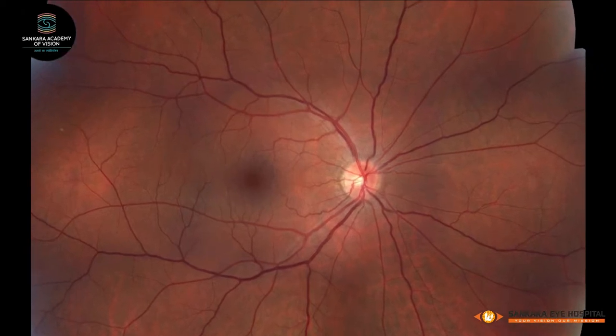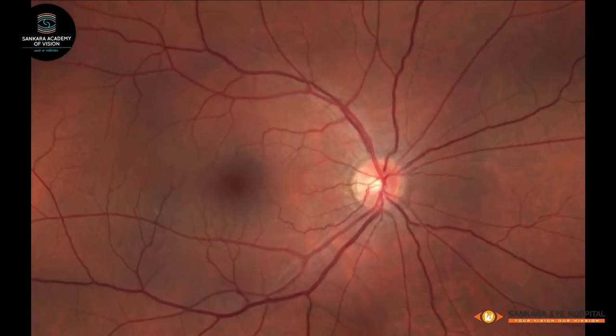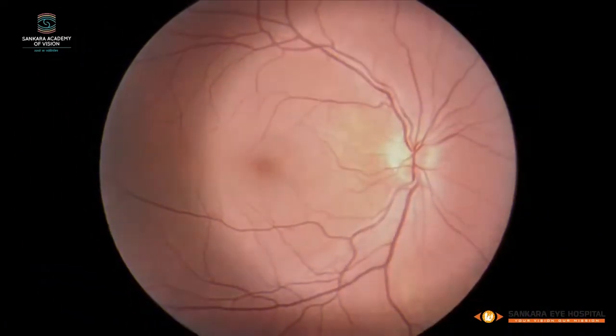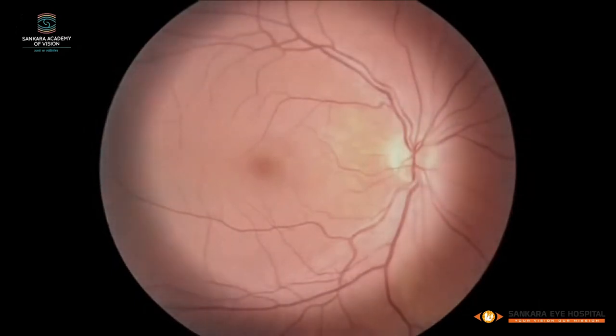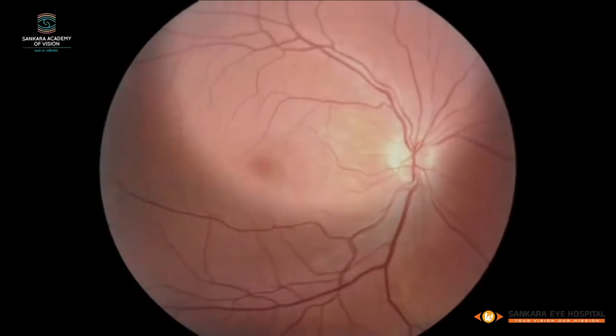The technique of examining the fundus of the eye is called ophthalmoscopy. Although there are several types of ophthalmoscopy, in this video we will learn to perform binocular indirect ophthalmoscopy.